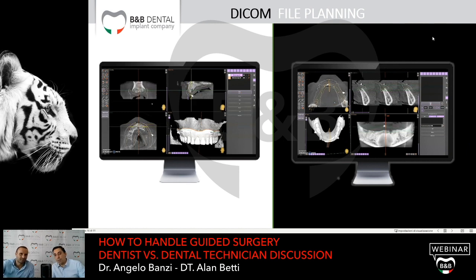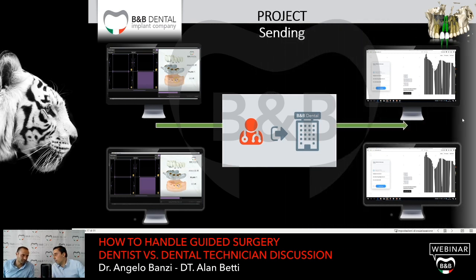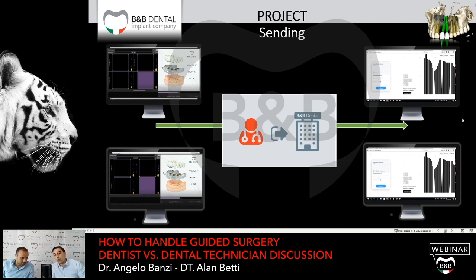So if you have a sleeve +2, you can work with an implant of maximum 12 millimeters, because a 12 millimeter implant and a sleeve in position +2 is 14 millimeters, and 14 millimeters is the longest drill that we have in our surgical kit. This is a trick that we invented with our company when we noticed this problem, and it's very easy to apply.